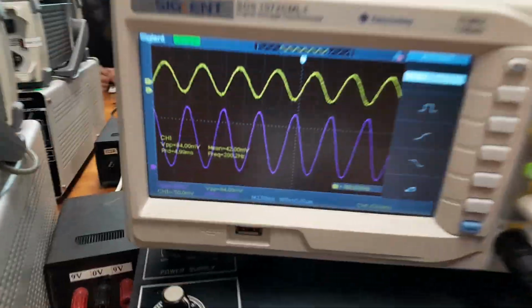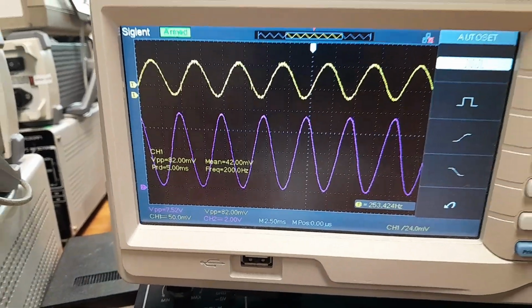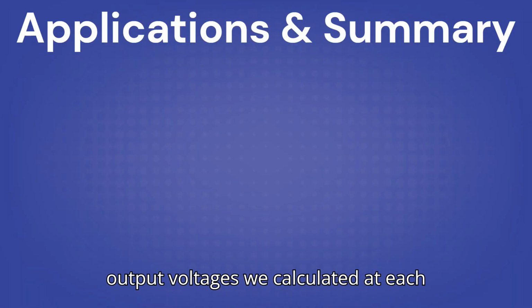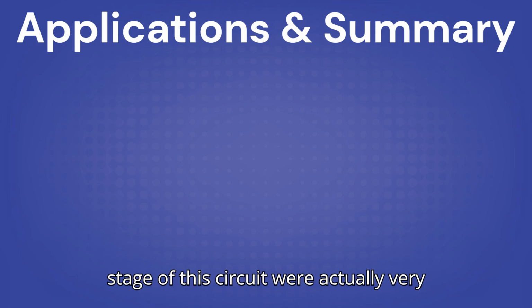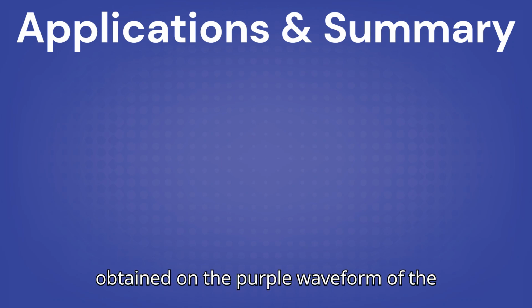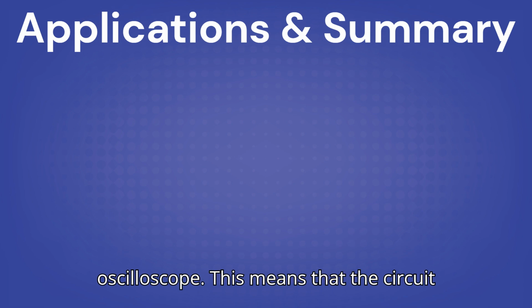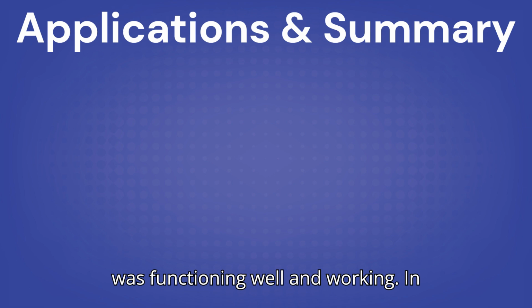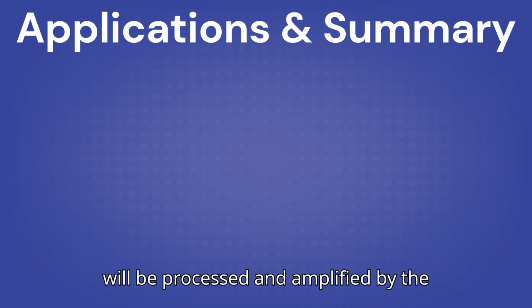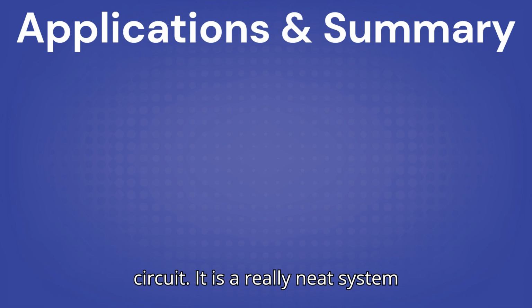To recap, all the theoretical expected output voltages we calculated at each stage of the circuit were actually very similar to the output voltages we obtained on the purple waveform of the oscilloscope. This means that the circuit was functioning well and working. In summary, I just explained how a biosignal will be processed and amplified by the circuit.